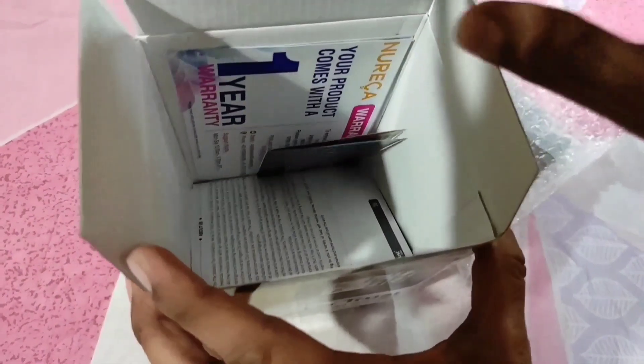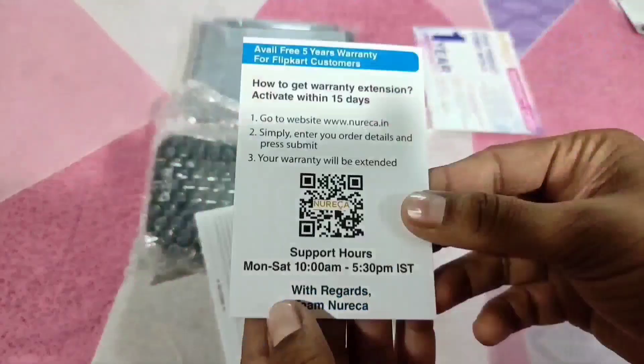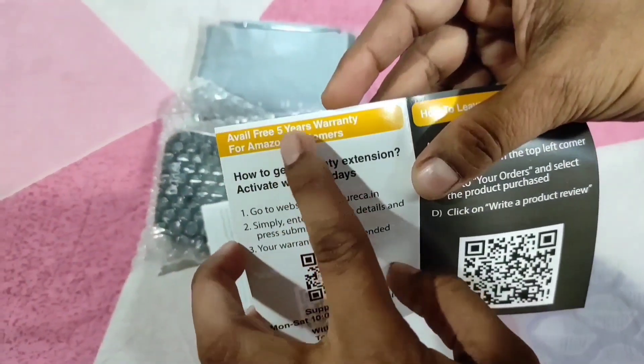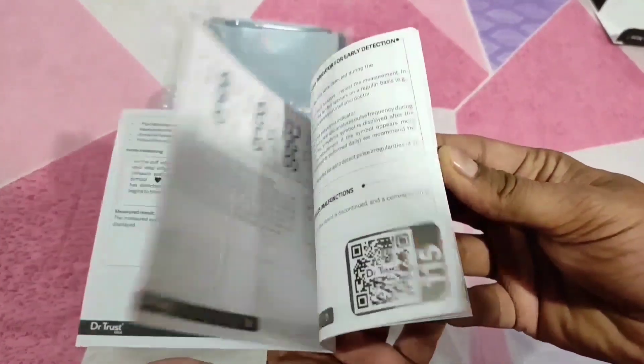After opening the box, you will get the BP monitor unit, the cuff, and some documentation. In this documentation, you generally get 1 year warranty. But if you want to extend the warranty up to 5 years, you have to register the product through the company's website within 15 days of purchase. And this is the user manual.